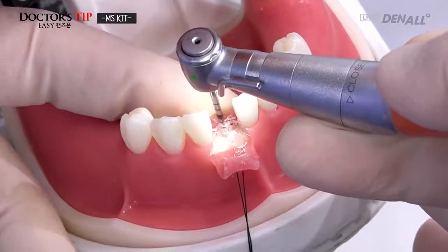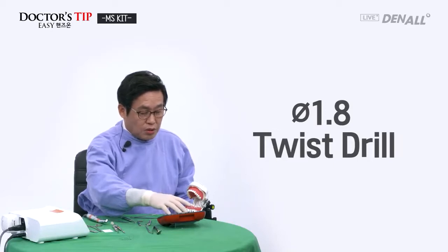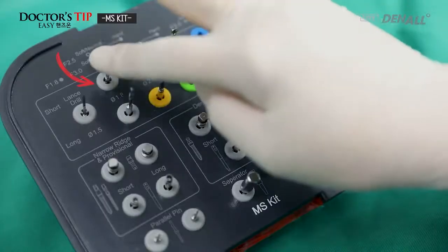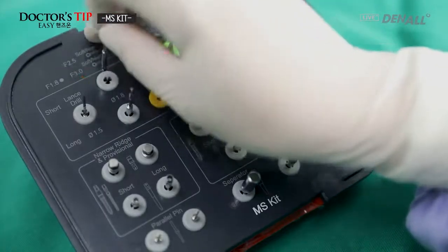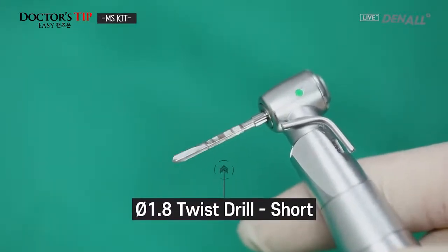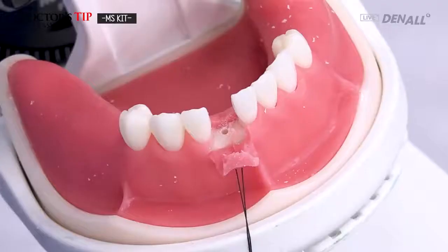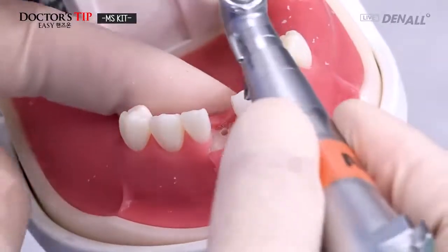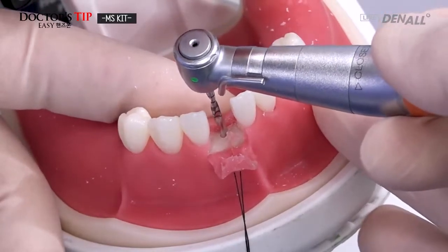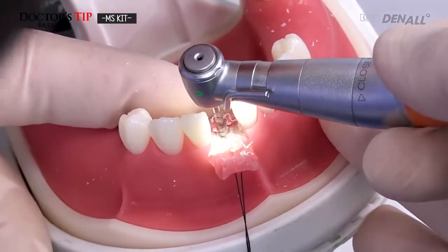put a hole in the cortical, and use the 1.8 diameter twist drill. You have short and long versions. I will use the short for my first drilling. So 1.8 twist drill, like this. RPM, I changed to 1200. And as you can see, in the area I placed, I position it, and the diameter 1.8 twist drill is used.